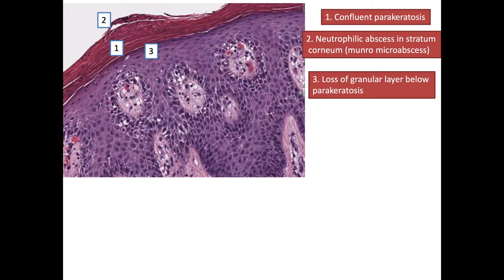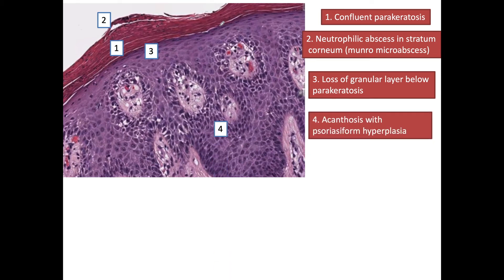The next change is loss of granular layer just below the parakeratosis — under the parakeratosis we see loss of the granular layer, but in the rest of the area the granular layer can be present. The fourth point is acanthosis with psoriasiform hyperplasia. Acanthosis is the thickening of the spinous layer in the epidermis, and psoriasiform hyperplasia is defined as elongated bulbous rete ridges.